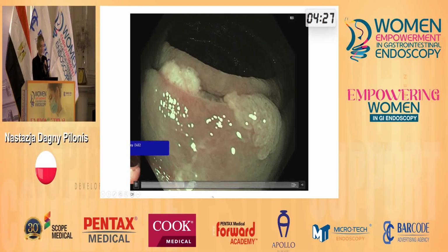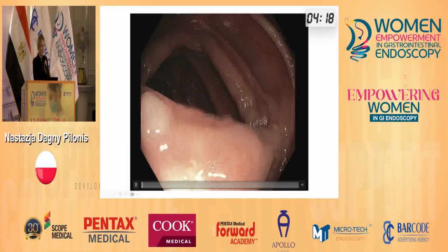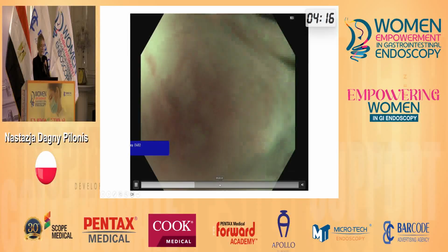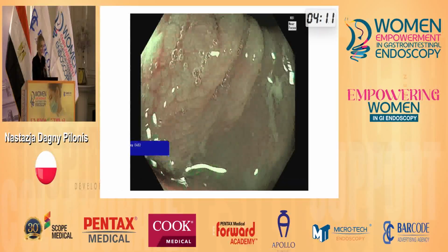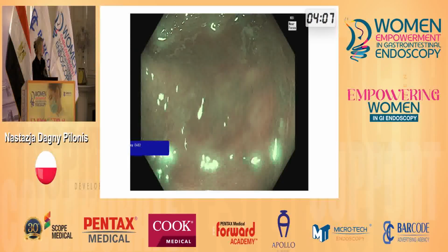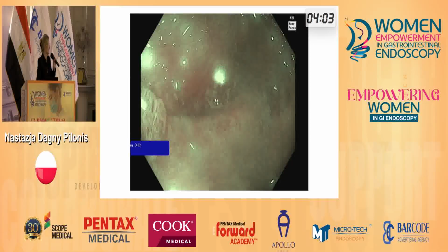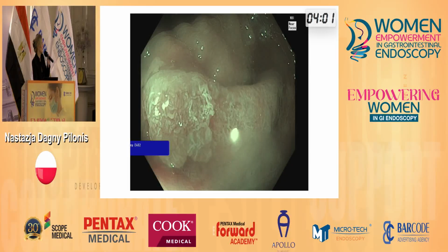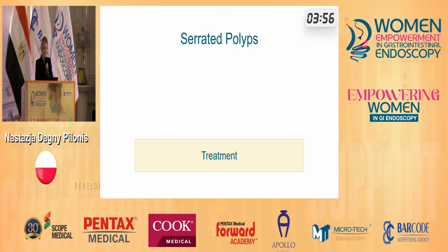And here you can see, when we switch on the contrast, we can actually delineate the lesion, and you can see this dotted line showed us this. For the sake of time, I can't go through the entire movie that I prepared, but I recommend you spend some time looking for those features that we discussed: clouded surface, irregular surface, and dark spots.